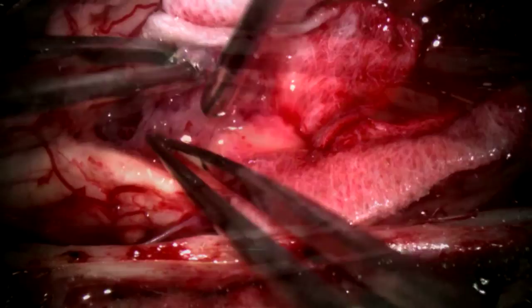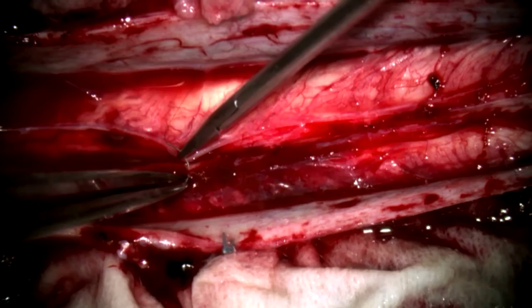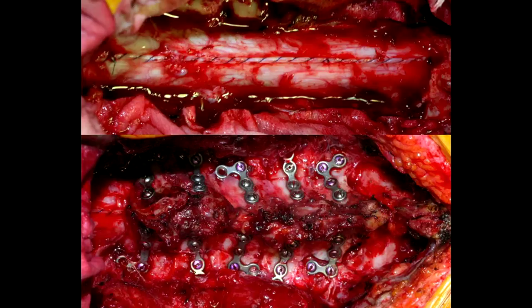As we can see, total removal of the tumor from all of its borders. Afterwards, we just closed the pia with pial sutures in order to close the cord again. And then the dura was closed and laminoplasty was implemented.